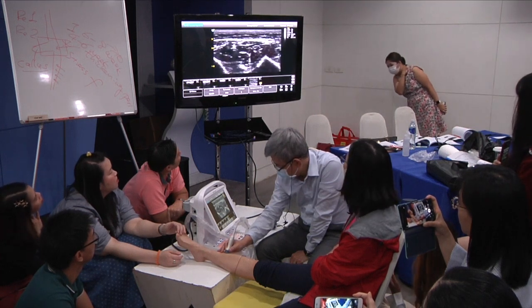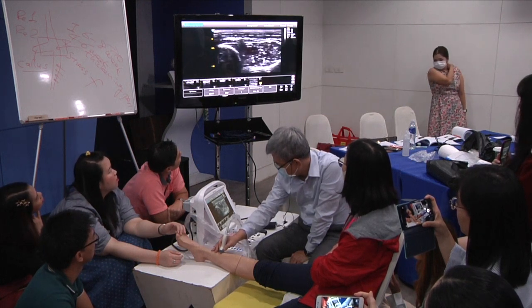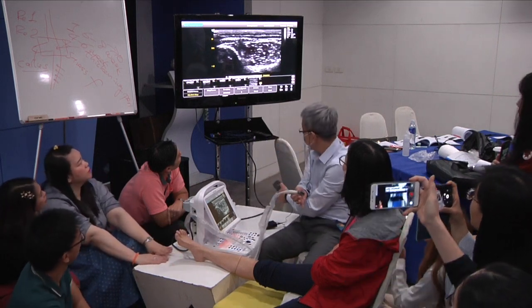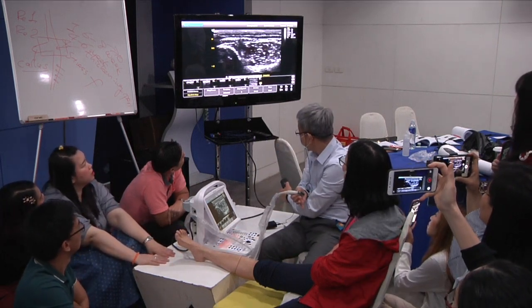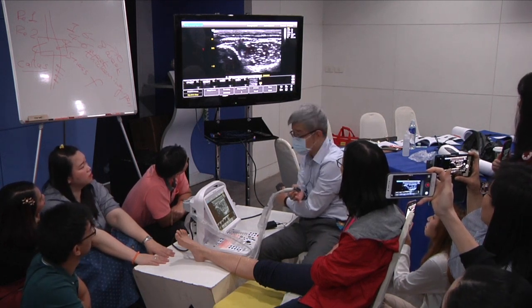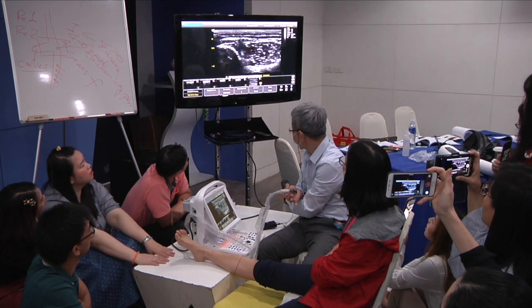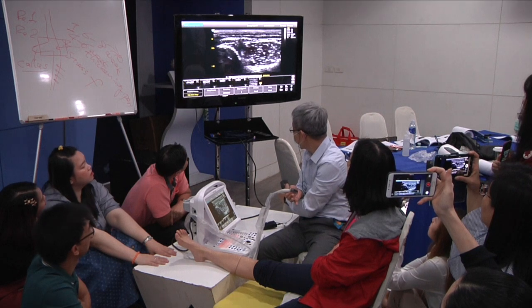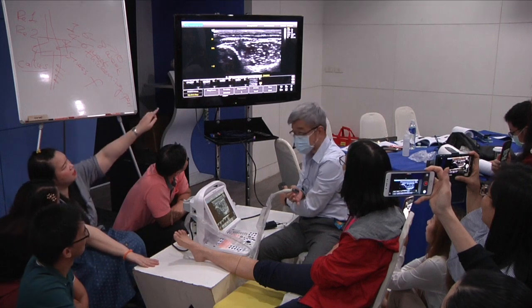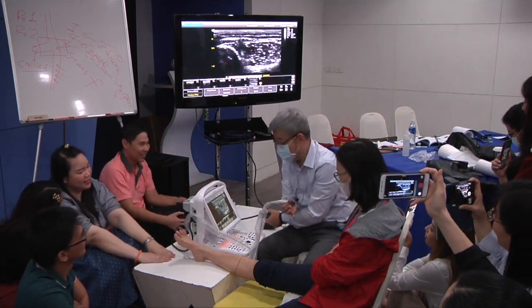Tendon. Right? So it's very interesting, right? Extensor tendon of tibialis anterior, extensor hallucis longus. If you cannot find the tibialis anterior, or you cannot find the extensor hallucis longus, they stay together like a high school boyfriend and girlfriend, but they separate eventually. Oh, sorry, for some cases, yeah.